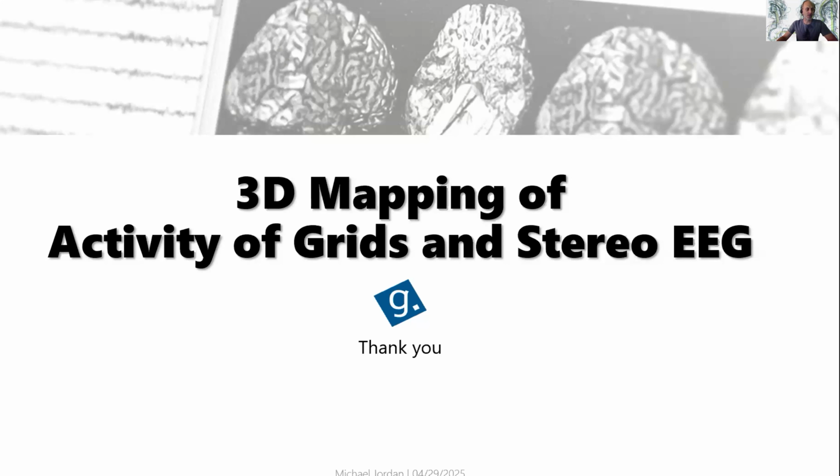So maybe I can answer it. Stereo-EEG is not coming from the stereo sound stuff with left and right ear. It's coming from stereotactic EEG, because you need a stereotactic device to insert a kind of needle electrode into the brain. So you need a 3D environment to know where the electrode is going. And even with such a stereotactic device, which is guiding the electrode, sometimes the electrodes end up in a different brain region.